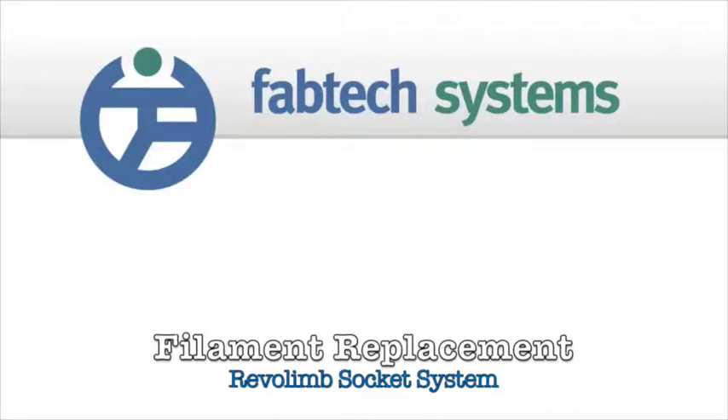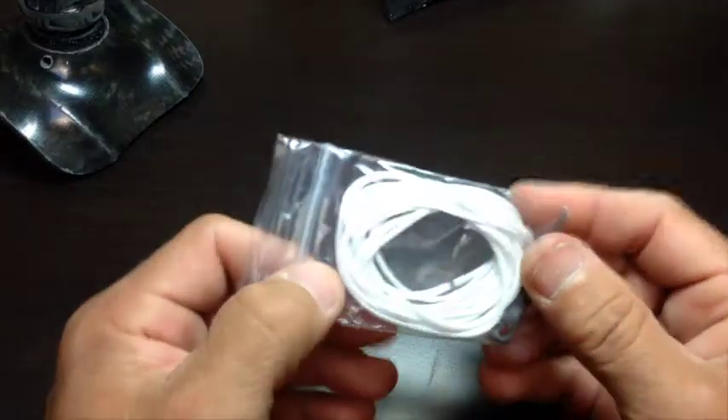Scott Wemberley with Fabtech Systems here to show you how to replace the filament on the RevoLimb socket system. While this isn't an everyday occurrence, it is something people should be prepared to do as part of continual maintenance.